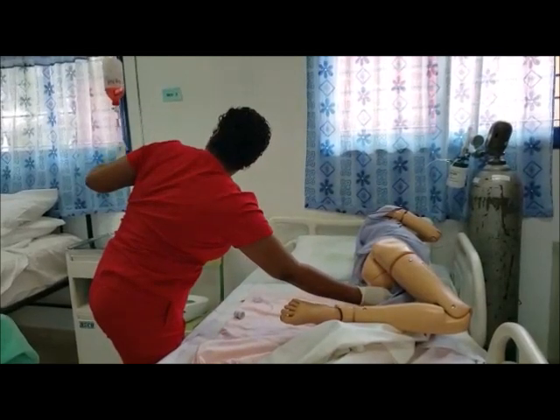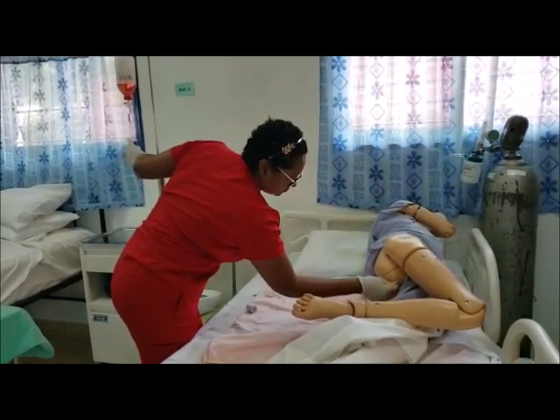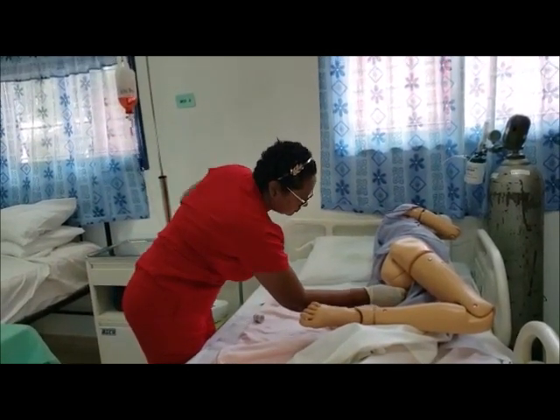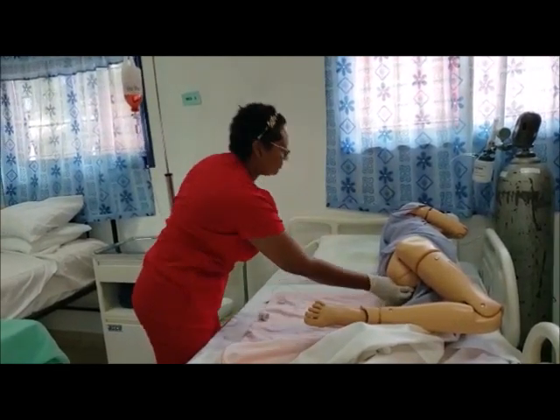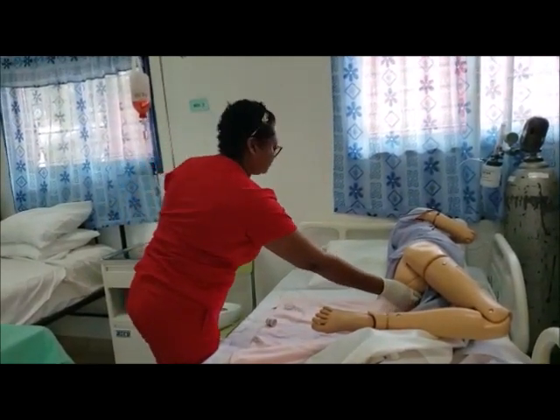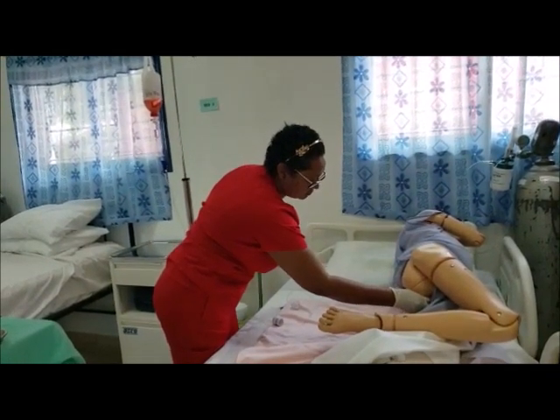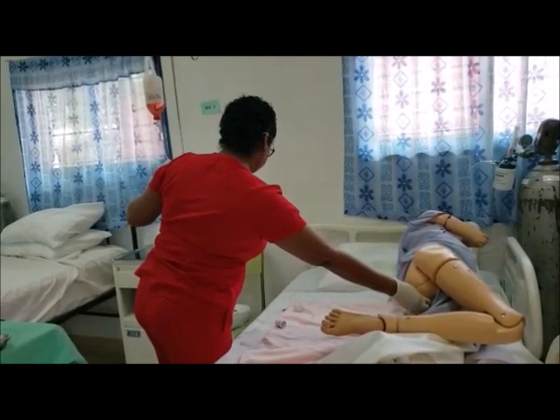Remove the tube and check for fecal impaction. Reinsert the tube in direction of the umbilicus. If patent, continue with administration. Raise the solution container no higher than 30 cm above the rectum and open the clamp. Administer the fluid slowly.